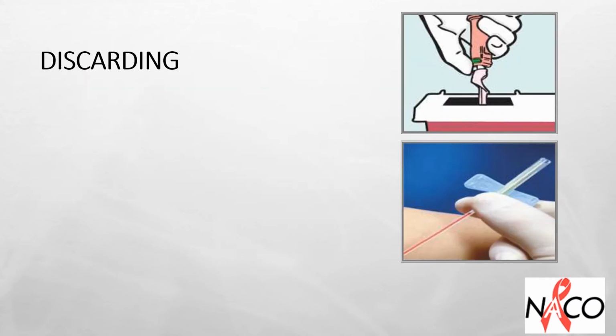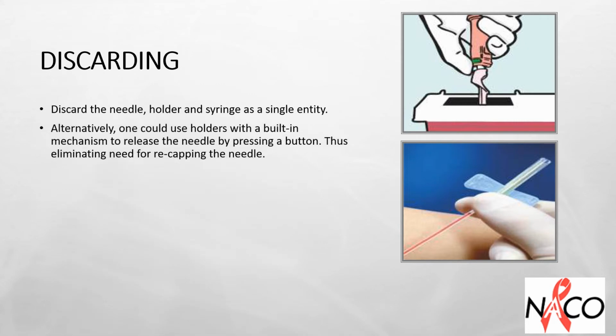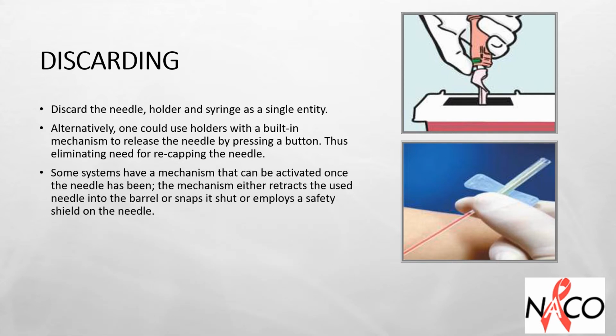Always discard the needle holder and syringe as a single entity. Alternatively, one could use holders with a built-in mechanism to release the needle by pressing a button, thus eliminating the need for recapping it. Some systems have a mechanism that can be activated once the needle has been used. The mechanism either retracts the used needle into the barrel or snaps it shut or employs a safety shield on the needle. Vacuum systems may also be used with a winged butterfly needle and luer lock connectors.